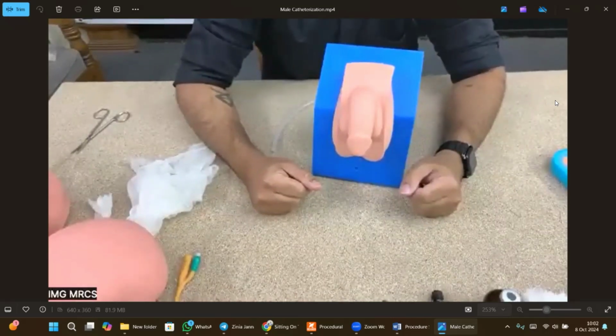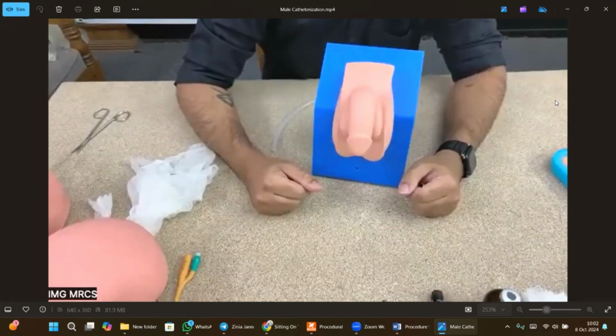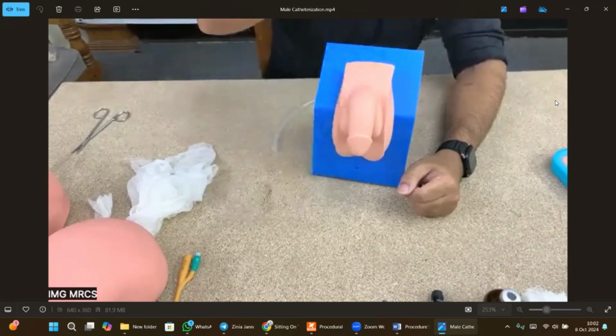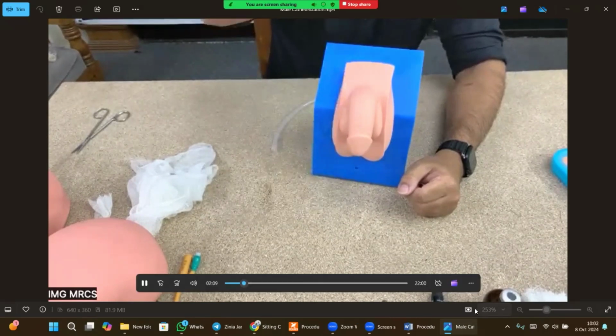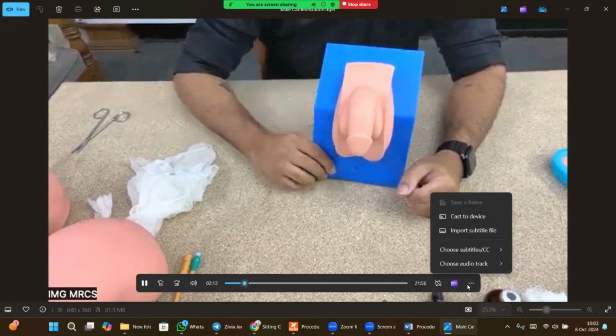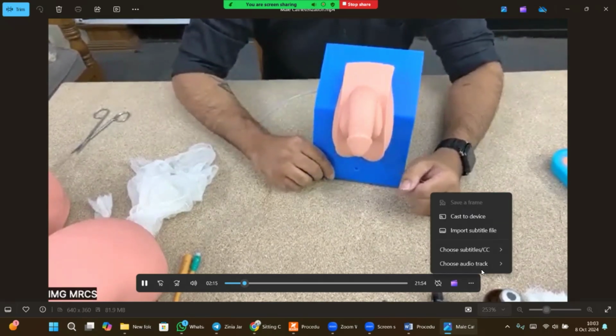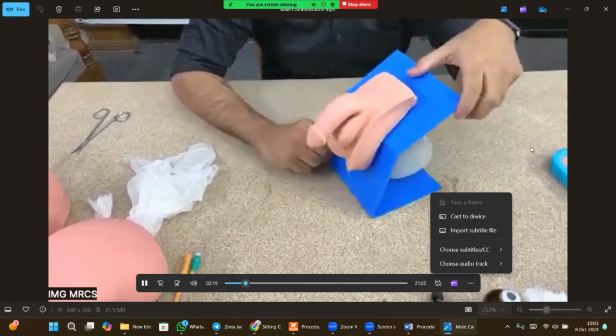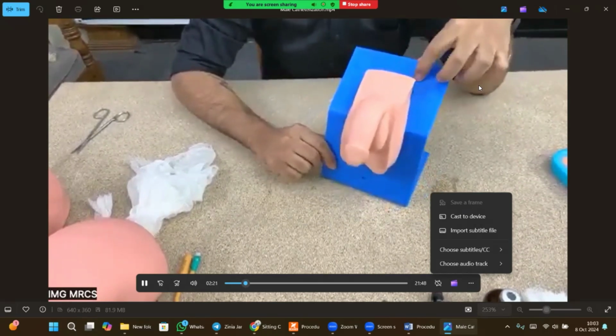Also, you are going to need an appropriate urinary catheter, a 10 ml syringe and also some distilled water, and you are going to have a Euro bag along with that, okay. At this point, you have to see whether the patient is properly positioned or not, okay. So now what we have to do is, first of all, we are going to wash our hands and we are going to wear gloves, okay.